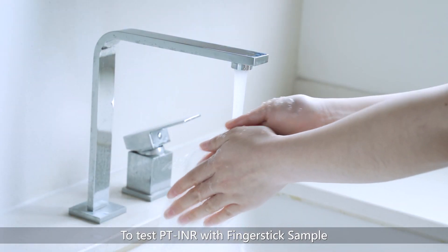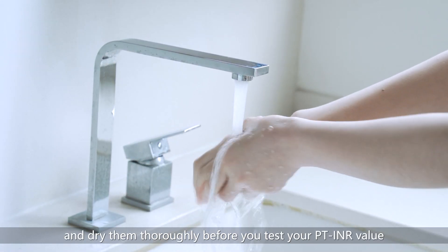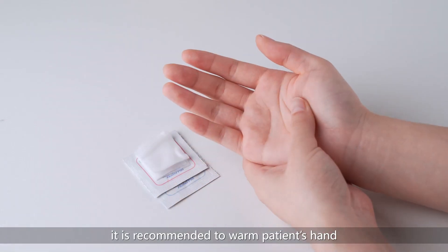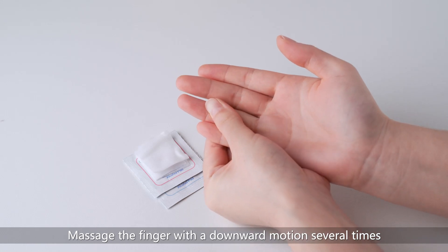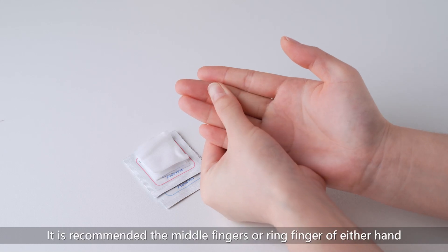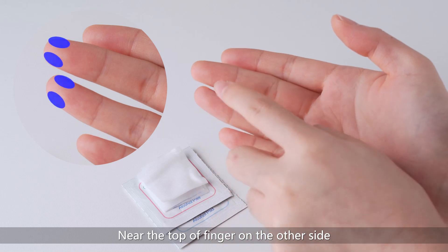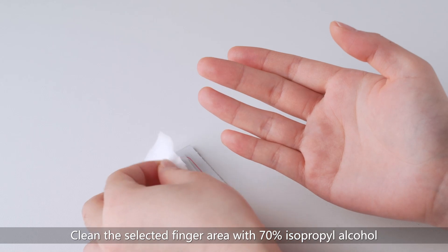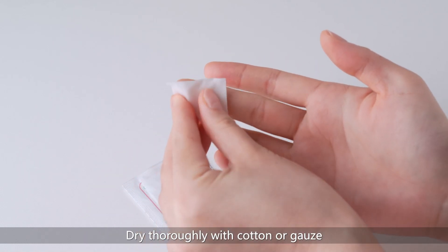To test PT INR with a finger stick sample, wash your hands with warm water and dry them thoroughly before testing. To maximize blood circulation, it is recommended to warm your hand in warm water or with a heating pad and massage the finger with a downward motion several times. Identify a site on the finger to puncture — the middle finger or ring finger of either hand is recommended, near the top of the finger on the side away from any calluses or scars. Clean the selected finger area with 70% isopropyl alcohol or an alcohol pad, then dry thoroughly with cotton or gauze.